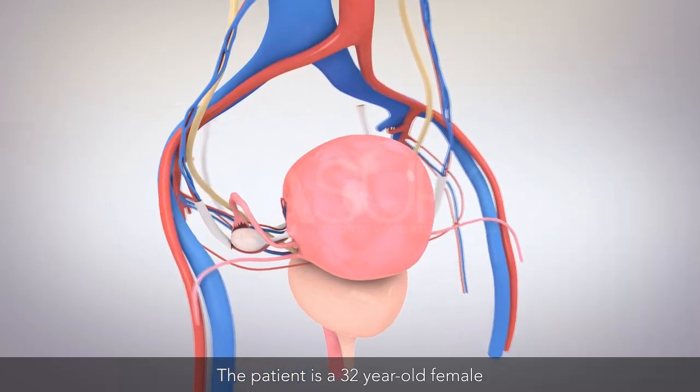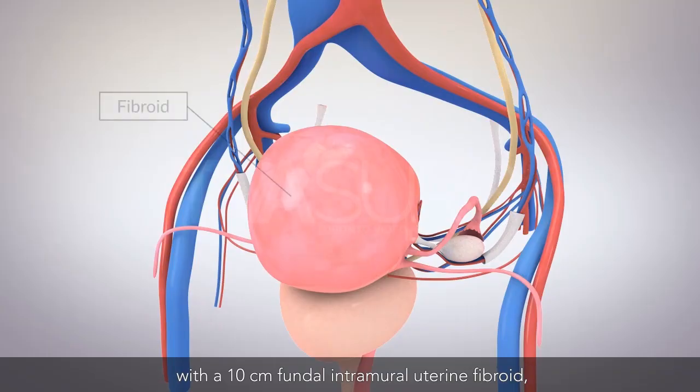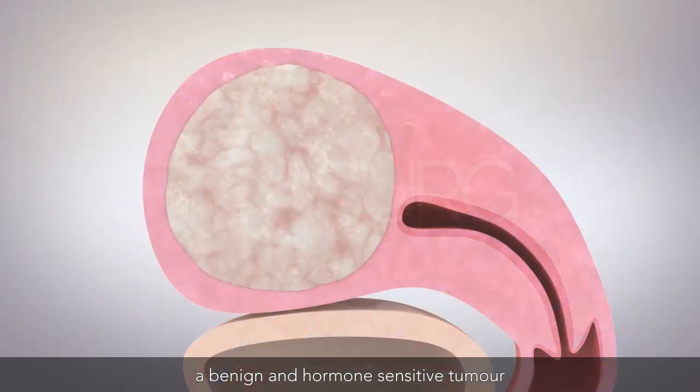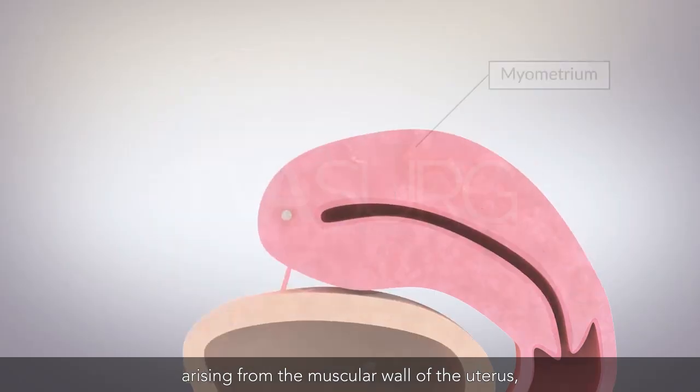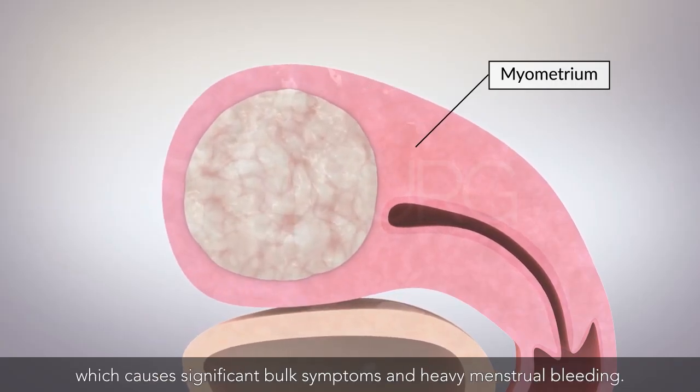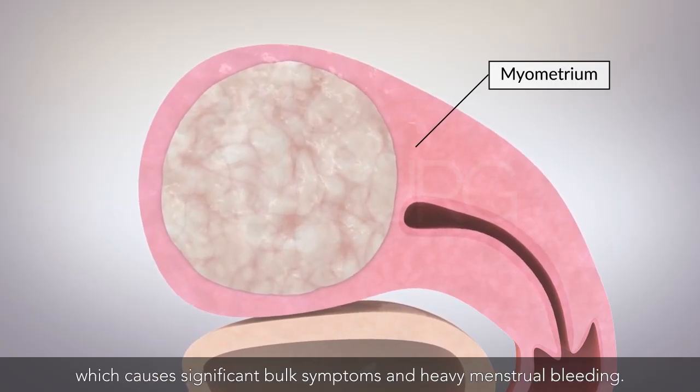The patient is a 32-year-old female with a 10-centimeter fundal intramural uterine fibroid, a benign and hormone-sensitive tumor arising from the muscular wall of the uterus, which causes significant bulk symptoms and heavy menstrual bleeding.